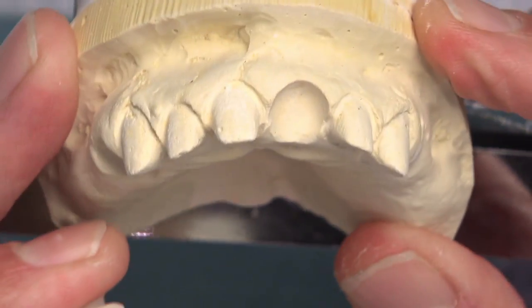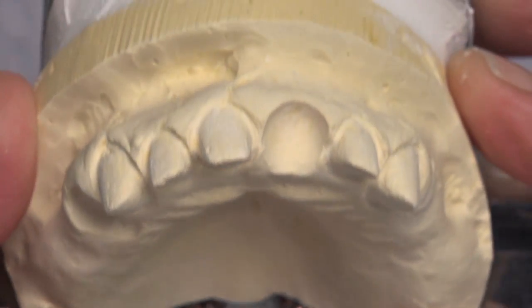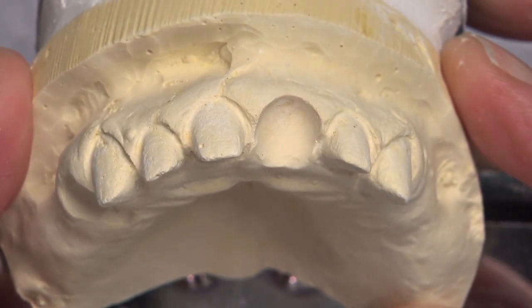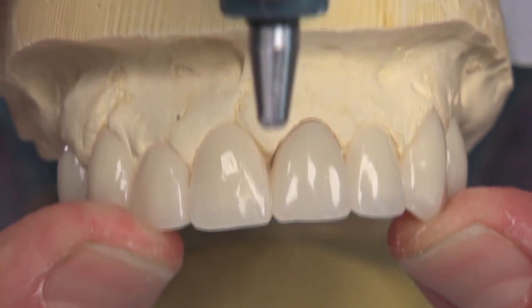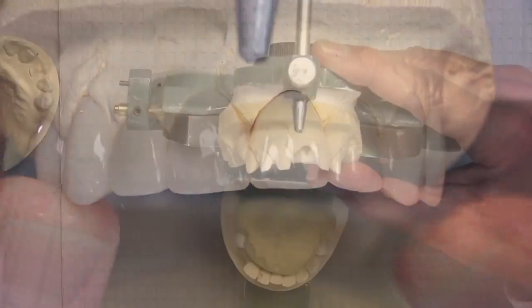To achieve that, we had to socket this model — we tend to go about five millimeters into the tissue. You've probably seen videos where I've gone in before and created that ovate pontic receptor site. If the extractions were done years ago, you can create it with either a hard tissue laser, a diode laser, or a round burr once you get to the bone — or you can do the whole thing with a round burr as well.